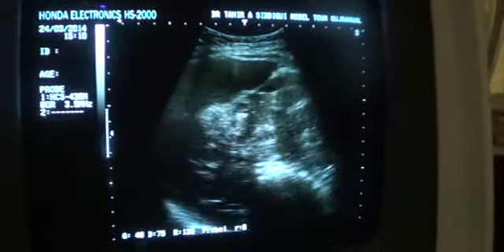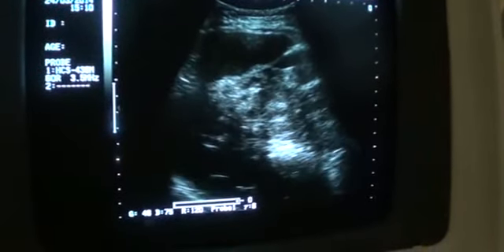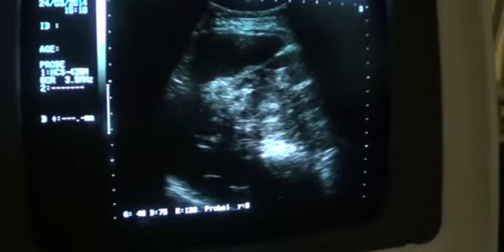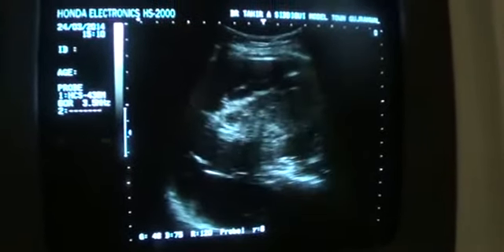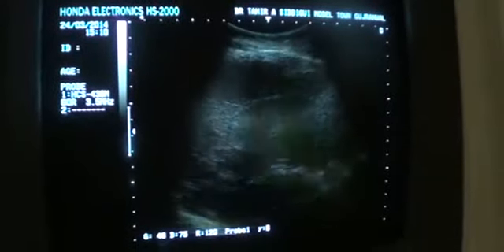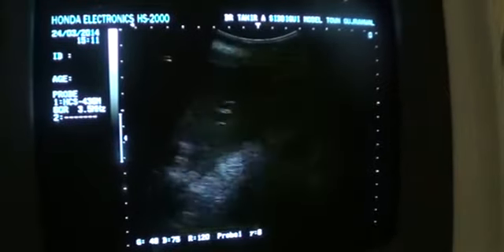Another thing is that we have to report the patency of the stent. You see, now this is the stent, and I can see the clearness of its internal lumen. So the stent is patent so far as I have seen.